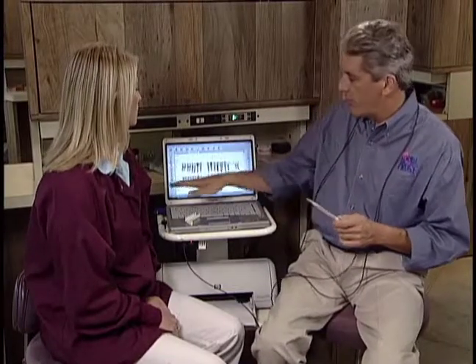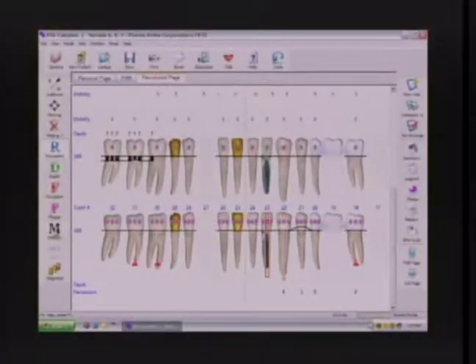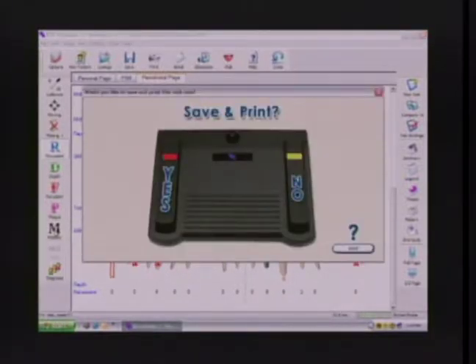While in the recession mode, the side pedals are minimal attached gingiva, no attached gingiva, and no attached gingiva. We can do that, or we've actually added an MGJ mode now. Let's look at it. I advance to the end of recession. Good strategy, pause. Am I confident I've recorded recession correctly? If so, I advance. Data collection complete.